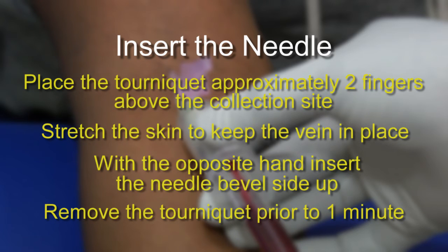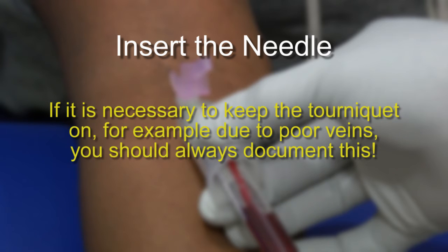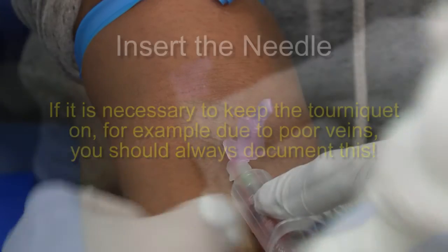Remove the tourniquet prior to 1 minute. In some cases, when you have a patient who may have poor veins, keeping the tourniquet may be necessary. Should this happen, you should document it.